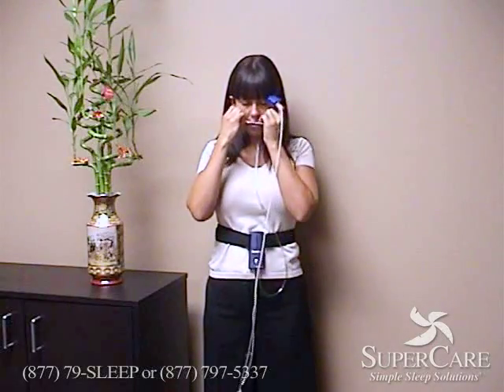Just take everything off, put it back in the container that it came in, and send it back to SuperCare.